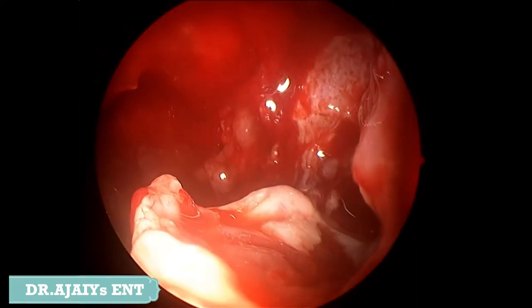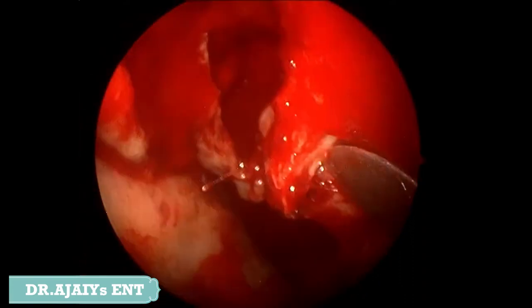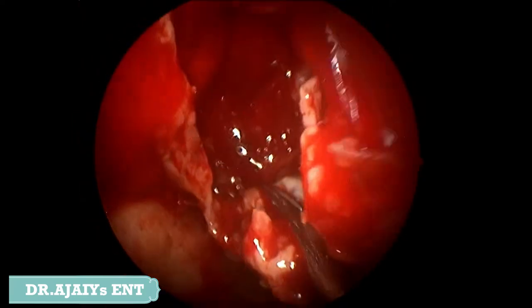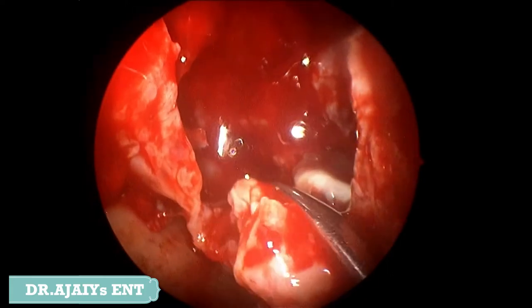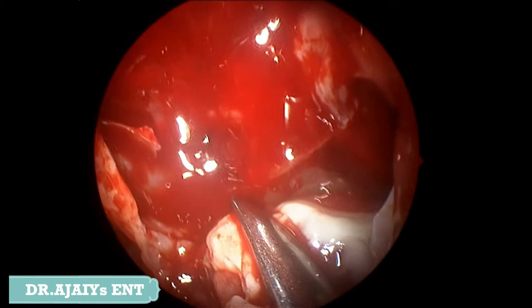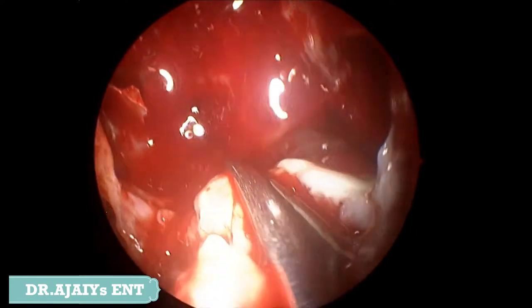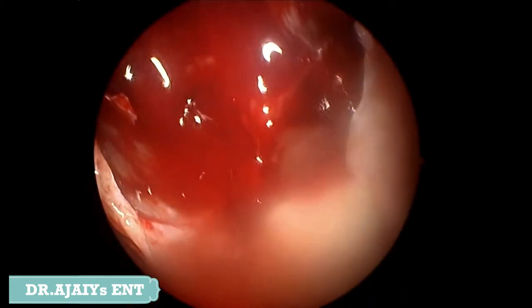Whatever we were removing was fungal material — that blackish eschar, the blackish material. This is not a clear-cut picture of advanced mucar; this is the early stage of mucormycosis. I am pulling out the medial wall of the maxilla which was breaking apart like necrotic contents, and we could see that blackish eschar over that area, which is the early finding. Fungal contents were present along the floor of the maxilla.